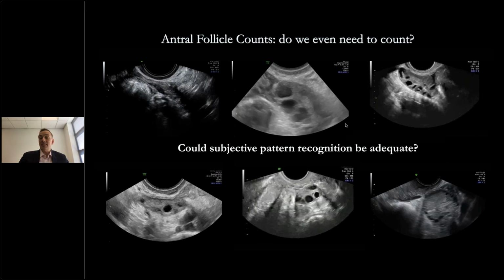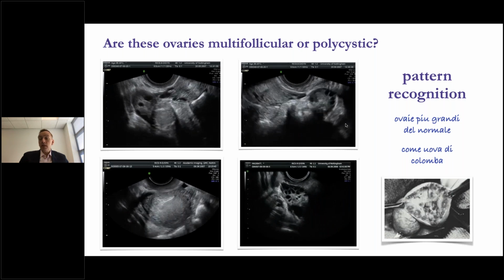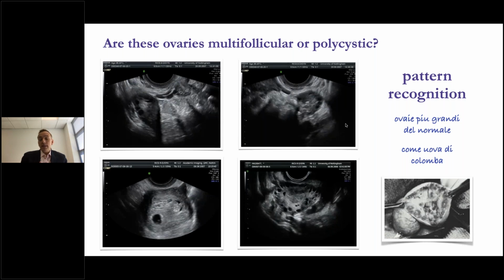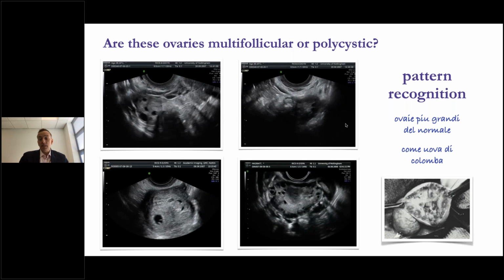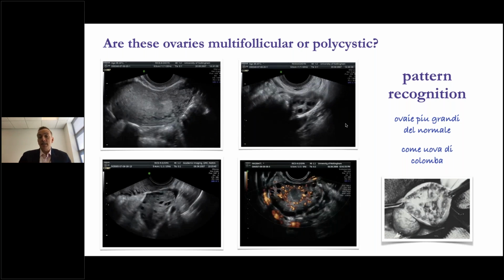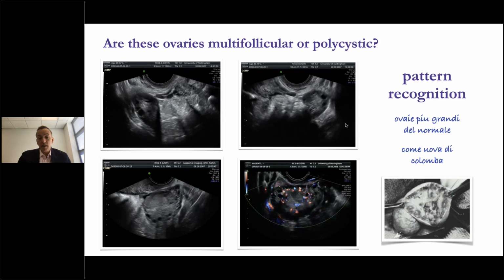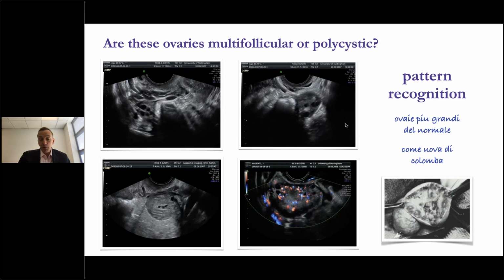And of course, it's got most relevance here. So PCO, it's still one of the most enigmatic diseases, or conditions, I should say. And again, I mentioned at the beginning, I know this is a particular issue in Asia, and there is a genotypic issue here. What's really strange about PCO is, yes, there's a follicle number. I think to some degree too much emphasis is placed on that. We can see here some of these patients in the bottom images have got hundreds of follicles. So this idea of whether it's 12, 19 or 20 follicles in an ovary, we're often talking about patients having 30, 40, 50, 60 follicles. But as you can see here, this lady has spontaneously ovulated.